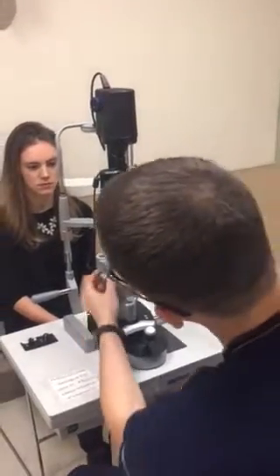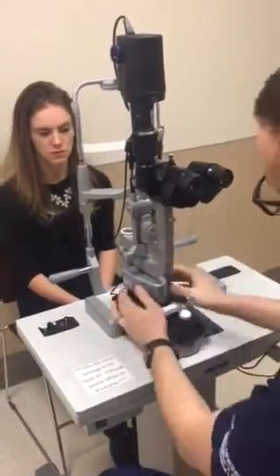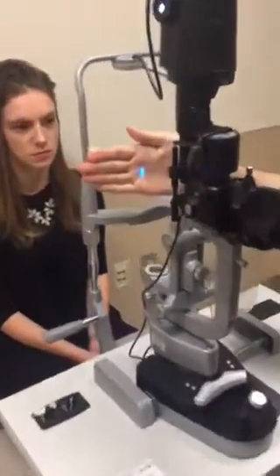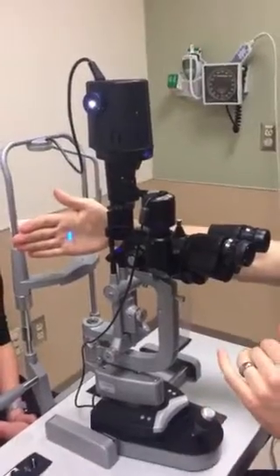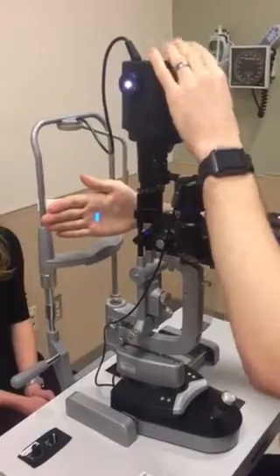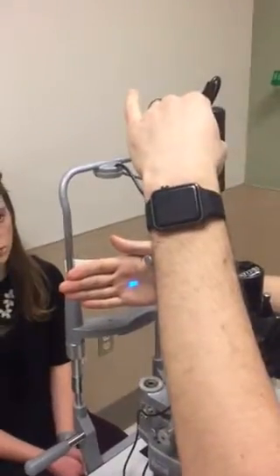Now turn the light on. Starting with blue light is not what we want, so we'll make some adjustments. Working from the top of the lamp down: this is your light source — make sure the light is in a vertical axis. You can see the beam on my hand; that's vertical, which is where you want to be. If you turn this, that's a horizontal axis.